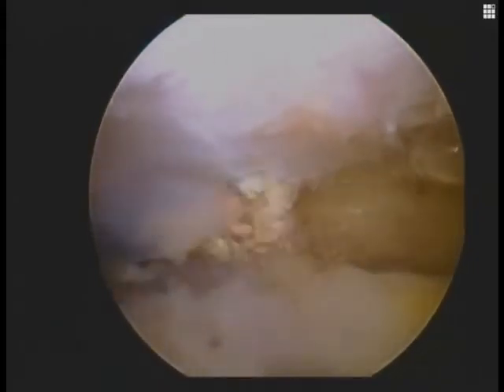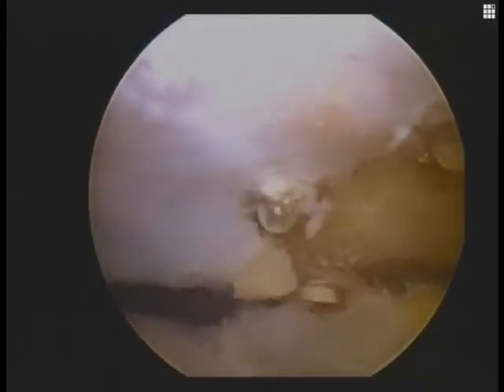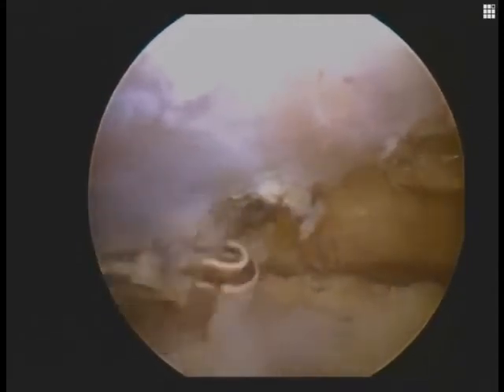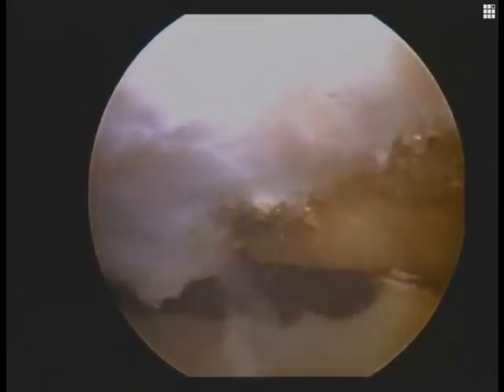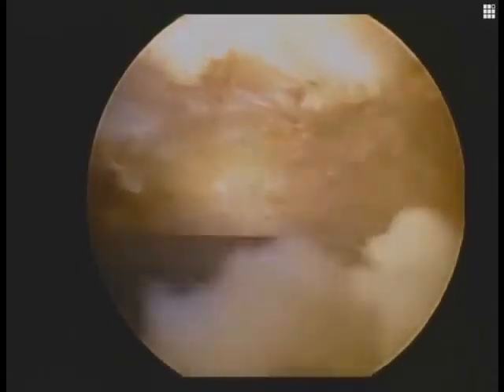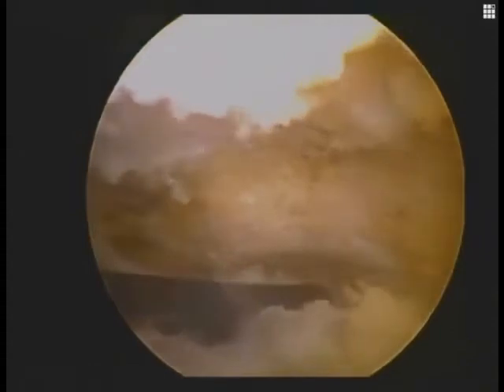Again we're viewing through the lateral portal and we continue to clean off the soft tissue to improve our visualization and to facilitate easy passage of the graft construct and passing sutures. Once we're happy with our visualization, we continue to clear off the medial remnants of any bursal tissue and control any bleeding with the hemostasis aspect of the device.